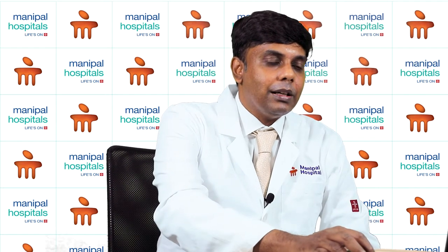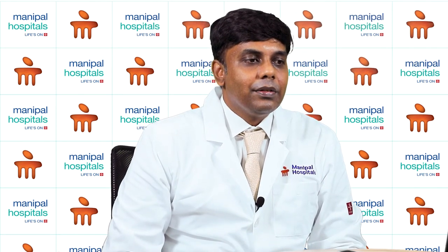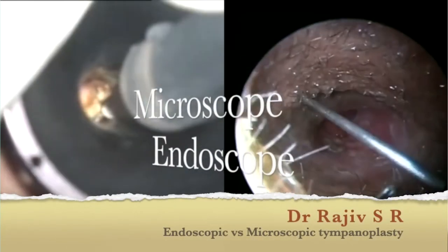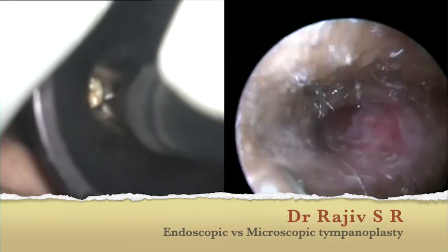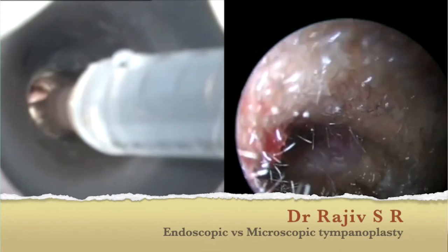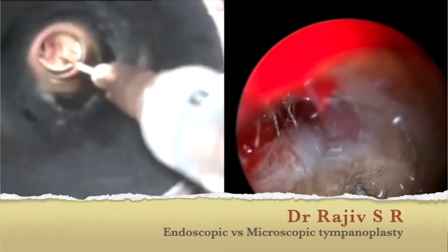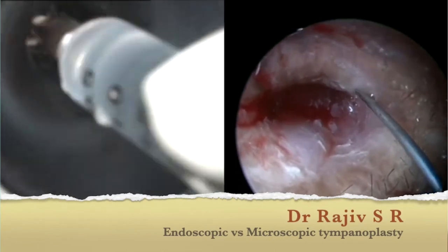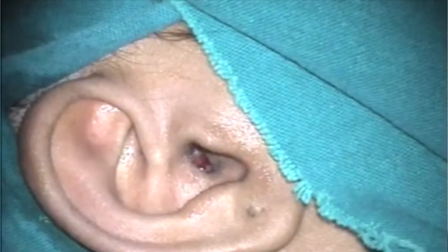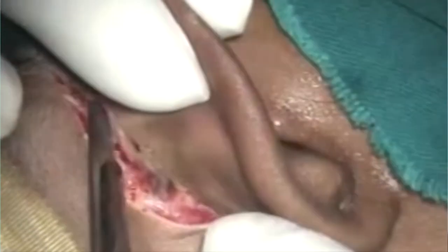In the video, two surgeries are going on simultaneously. On the right side of the screen you can see the endoscopic surgery; on the left side, the microscopic surgery. The first step is to infiltrate the external auditory canal with anesthetic and adrenaline solution to reduce bleeding during surgery. After infiltration, in microscopic ear surgery a large post-aural incision is taken, which is not required in endoscopic ear surgery. In endoscopic ear surgery, only a small incision is taken either inside the canal or in the hairline for the purpose of taking the graft.